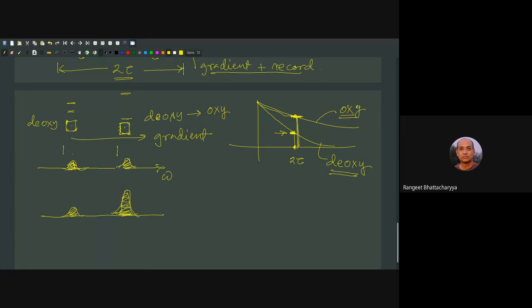That's fine. So if a simple question is asked that which of the box is more active, some activity is taking place in which of the box, you can answer that straightforwardly. You would say it's the second one, because during the activity, the deoxygenated blood was replaced by oxygenated one, and oxygenated hemoglobin is diamagnetic, and because it is diamagnetic, it interferes less with the nuclear relaxation. So net result is that the magnetization decays slowly. So it gives us more signal.